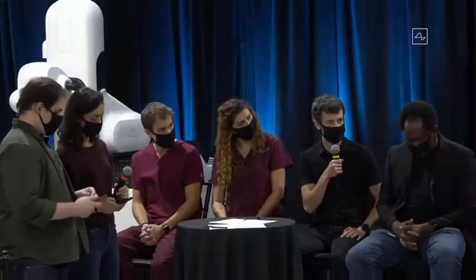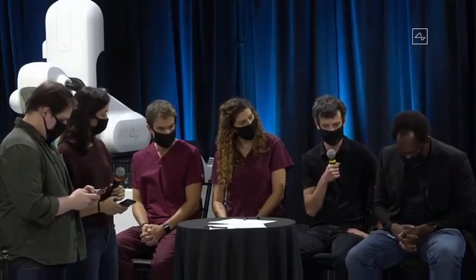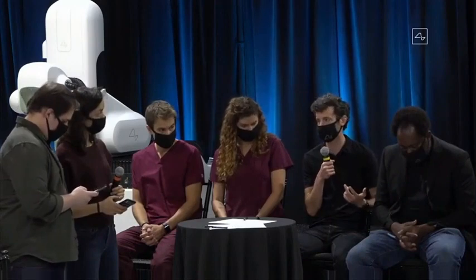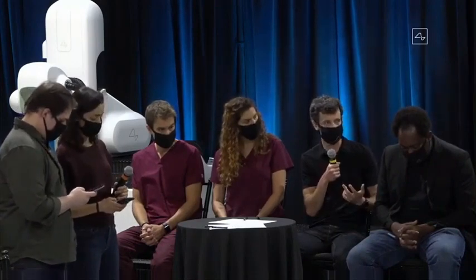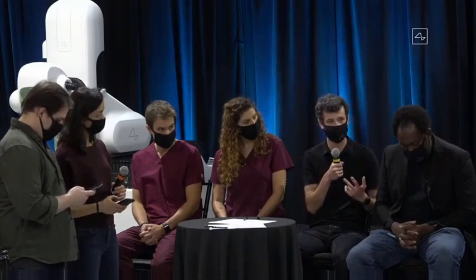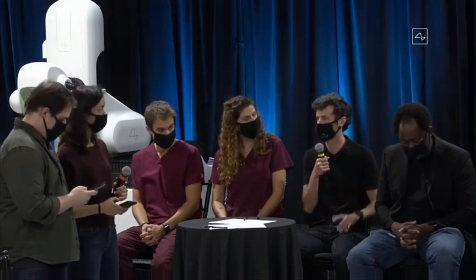I help make implants. And one thing that I think is really cool, just in general, is that this is a platform essentially, so we can change the design in a variety of ways. If we find that a certain design or electrode size or number of electrodes works better in different areas of the brain, we have the capability to do that. I personally think that's very cool. Fantastic. Anyone else? Dan, do you have something to add?